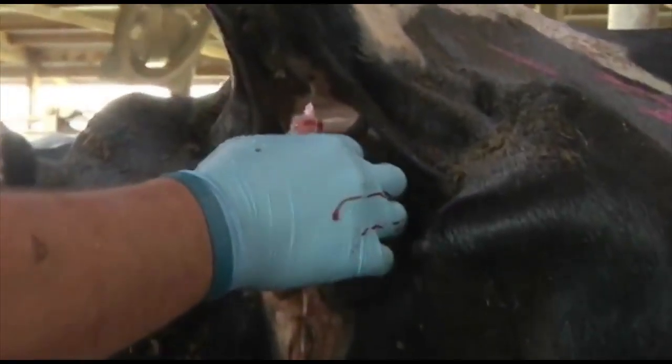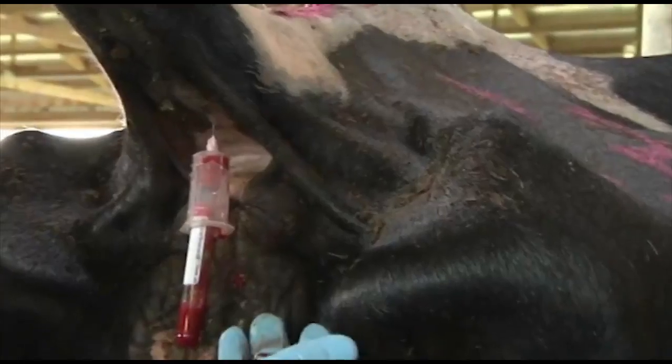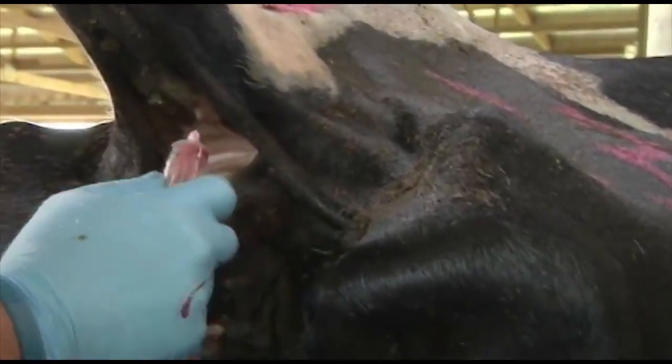If you go too far and scrape bone, you need to just pull back a little bit. If you don't get any blood, move it around and manipulate the needle until you do find blood. For the test, all we need is two cc's, so essentially we've got enough blood here to do the test.